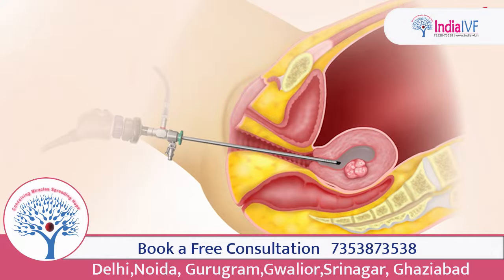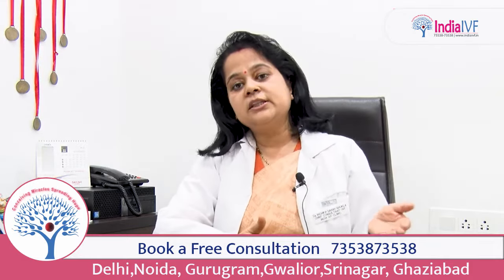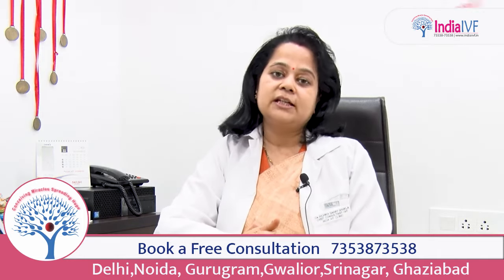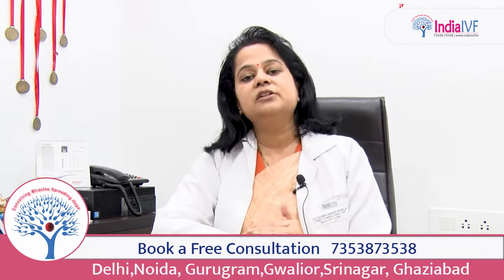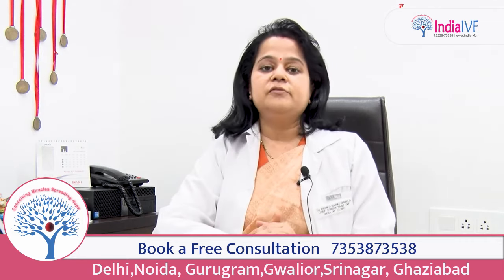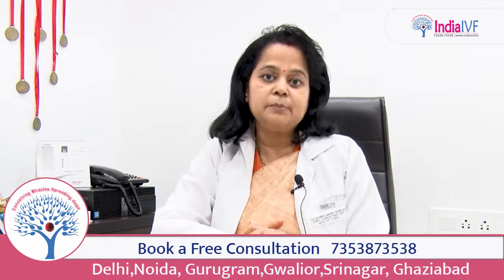And what can we do during hysteroscopy? We can increase the cavity size of the uterus, and we can increase the blood supply going inside the uterus. Secondly, we can cure the defect that is present in the uterus. Like if there is a septum or something, we can definitely remove that defect so that it increases the chances of you having a live baby.